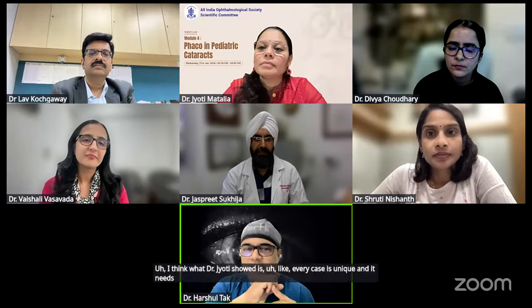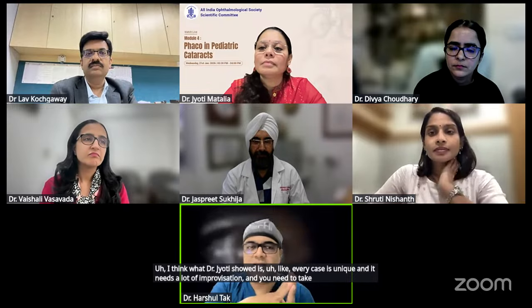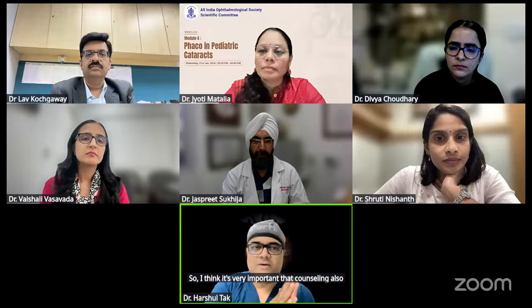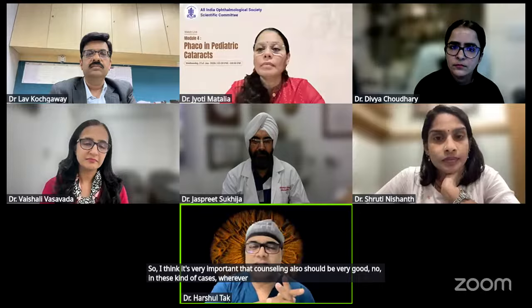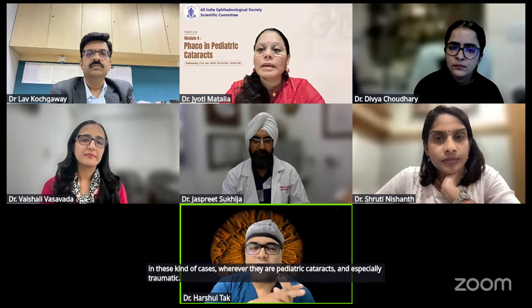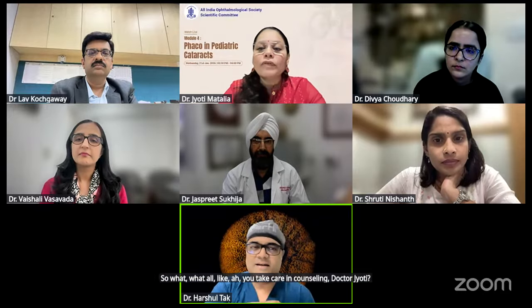I think what Dr. Jyoti showed is that every case is unique and needs a lot of improvisation, and you need to take many decisions on the table. So I think it's very important that counseling also should be very good in these kinds of cases, wherever it's pediatric cataracts and especially traumatic. So what all do you take care of in counseling, Dr. Jyoti? So first, it's very important to tell the patient the idea is that we are going to be clearing the cataract. There's no guarantee I'll be putting the IOL at the same time. We will also try our best, but it could be a staged procedure.